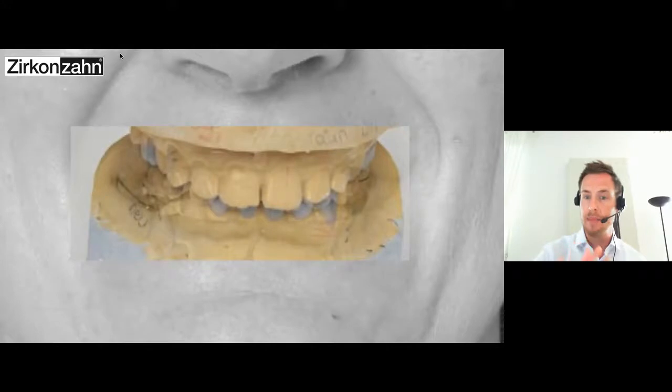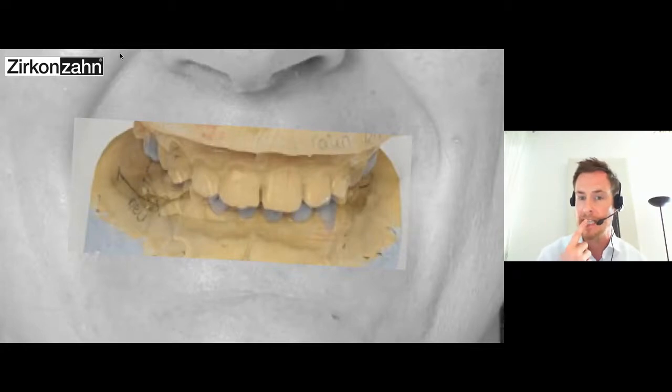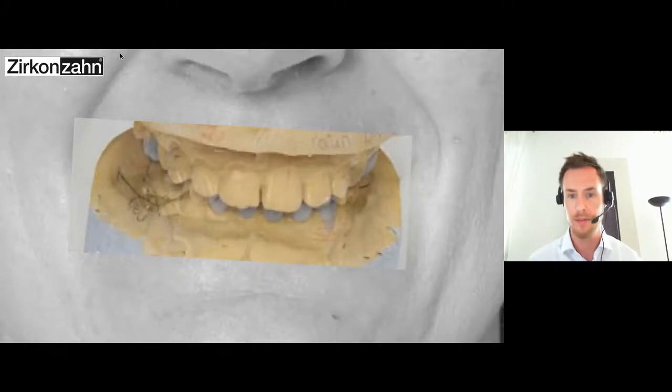And let's think a little bit differently. Let's think, okay, maybe we have a small mistake in the horizontal axis. And I, as a technician, now have the task to rebuild tooth 1-1, the incisor in the first quadrant, and to make a crown or whatever. And I use, as usual, the adjacent incisor as a reference. So I make the same shape, the same length, and all those things. I invested a lot of time, a lot of love, obviously. And after that, I send it back to the doctor, and he wants to cement it into the patient's mouth.